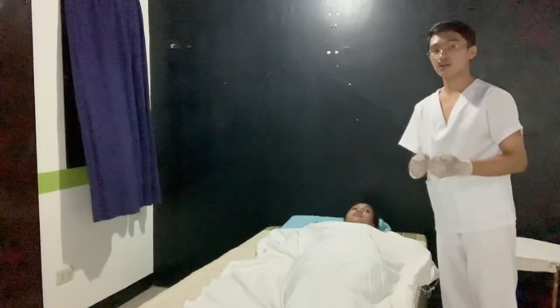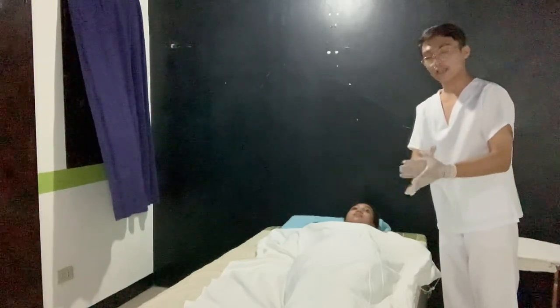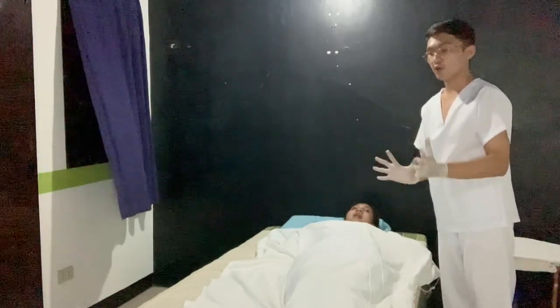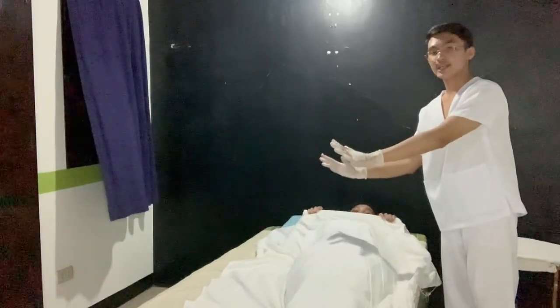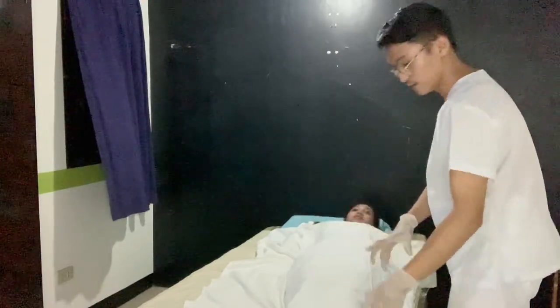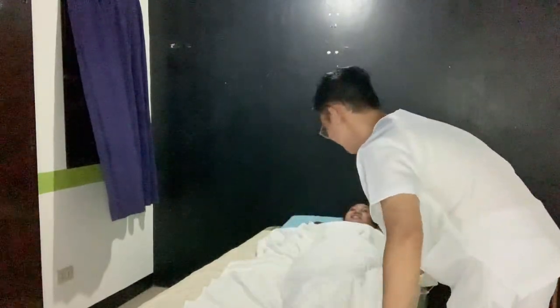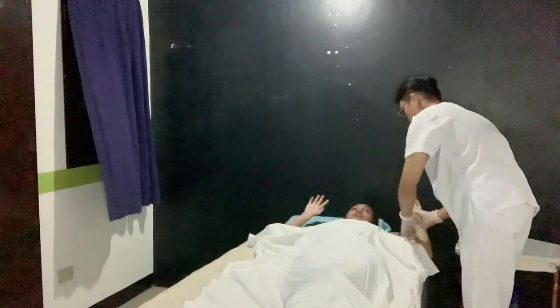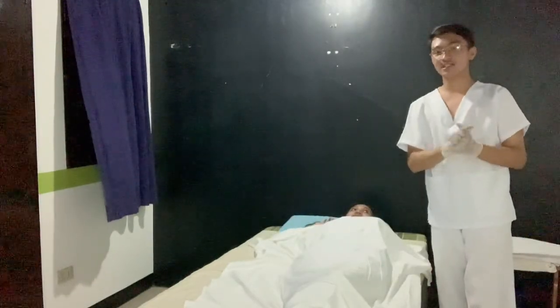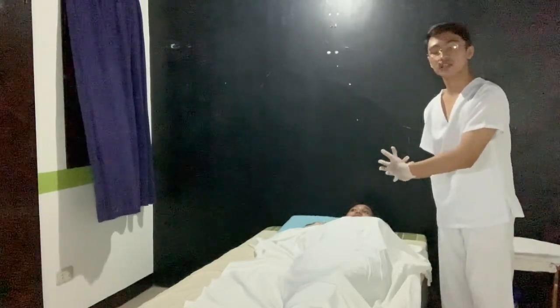I will now instruct the patient to cross her legs or feet and position her arms to prepare to roll over on the side of the bed. Ma'am, can I touch your feet? Yes. Now I have already positioned and instructed the patient to cross her legs and to position her arms.